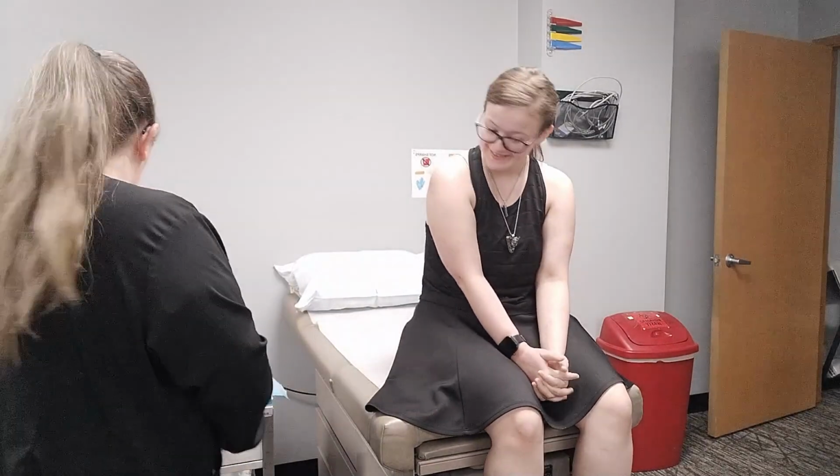My name is Penny Elaine and my date of birth is October 1st, 2000. Thank you so much. All right. So the doctor has ordered a Strep A test. Have you ever had one of those done before?